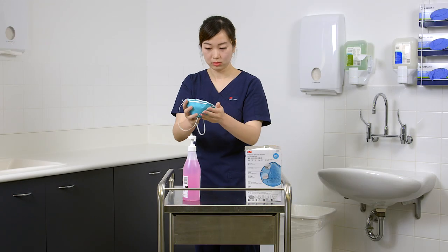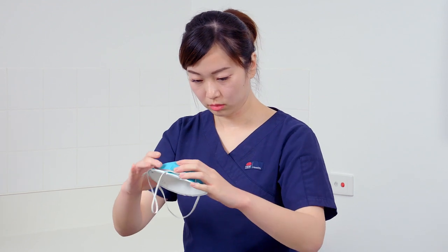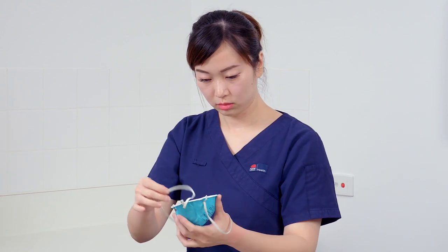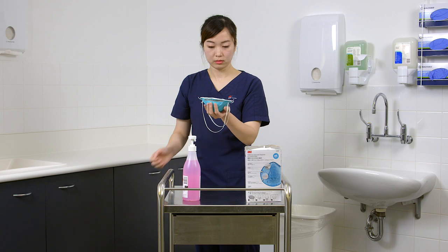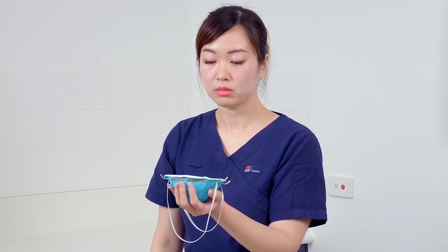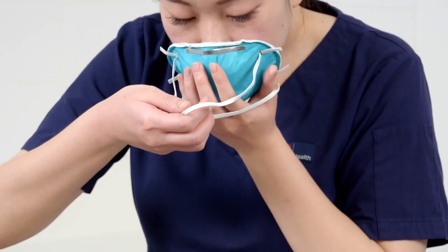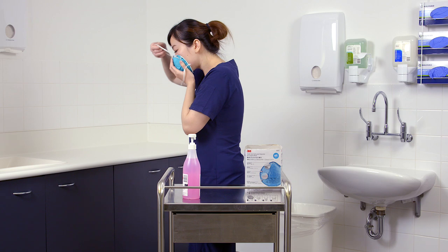To don the respirator, remove it from its packaging and inspect all respirator components for damage prior to use. Cup the respirator in one hand with fingertips positioned at the nose piece and straps hanging below the hand. Place the respirator against your face, positioning it under the chin with the nose piece across the bridge of your nose.